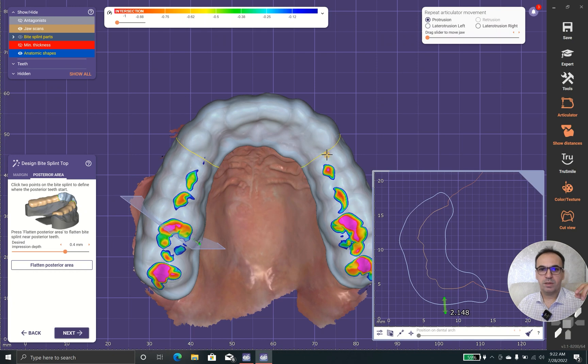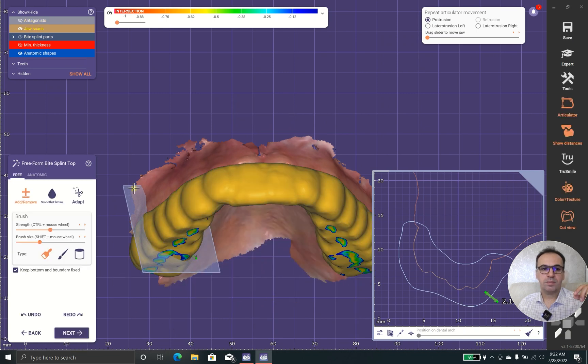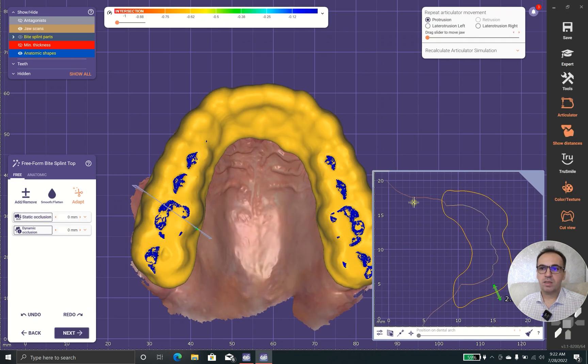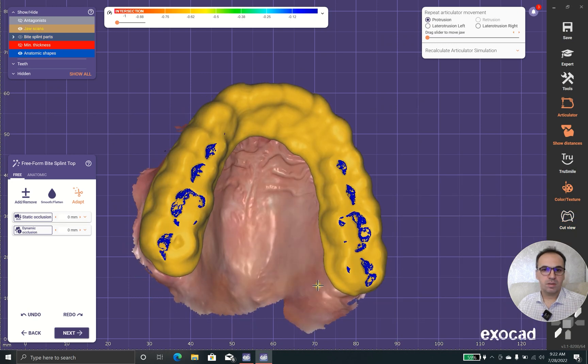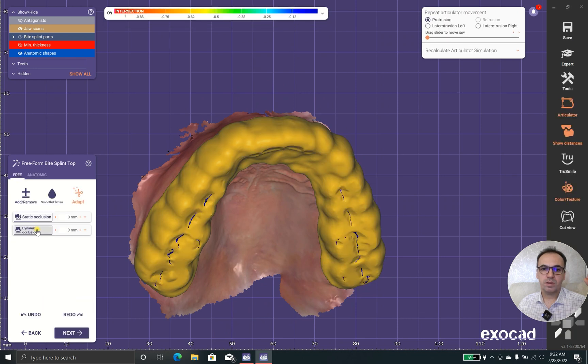I prefer the posterior parts to get flattened. We have static occlusion and we have dynamic occlusion. Let's try static occlusion first — as you can see the indentations are made, but these are not dynamic.